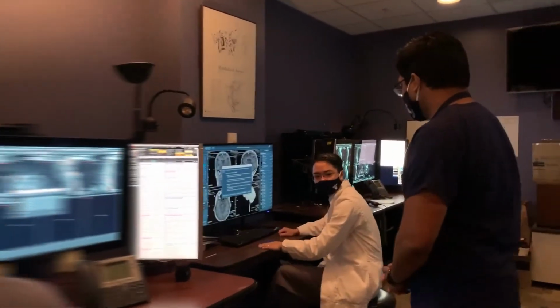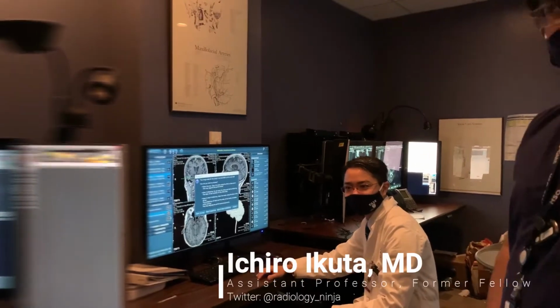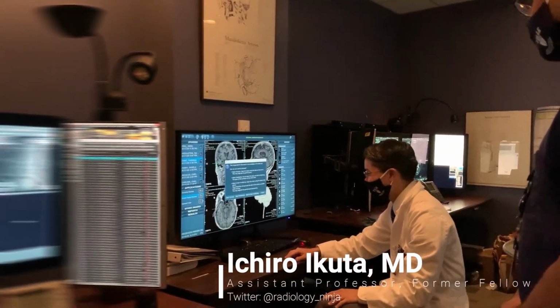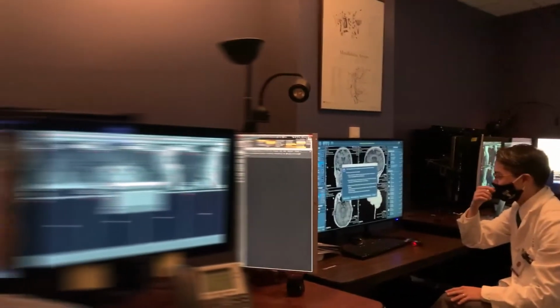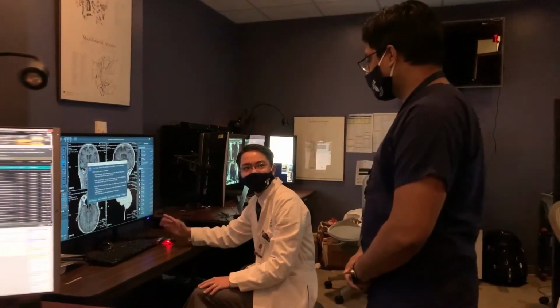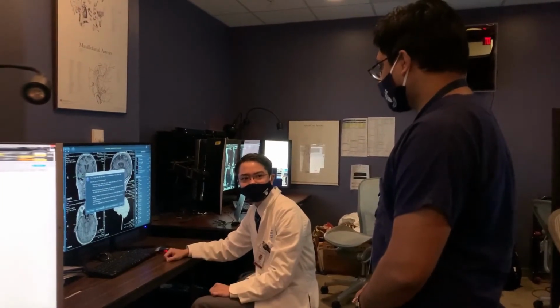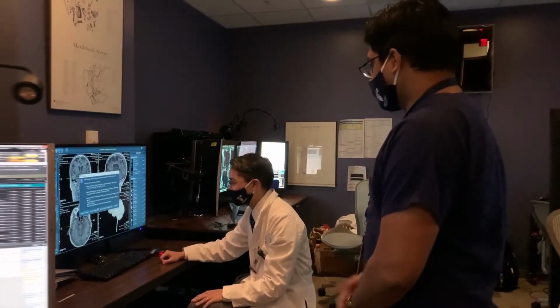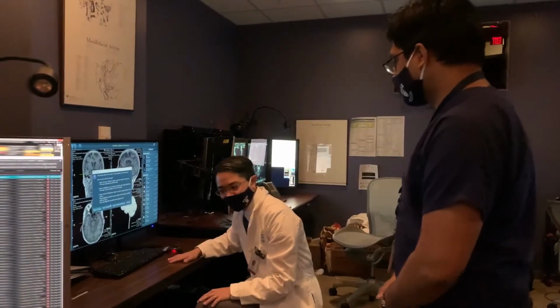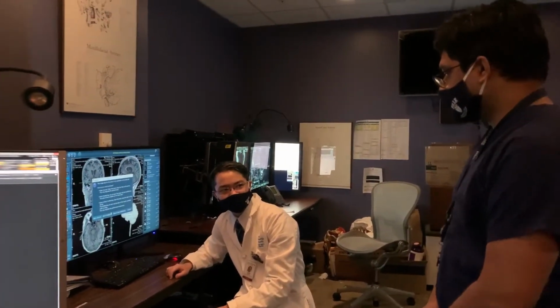Dr. Kuda, how are you doing? One of our faculty members. Hey, everyone. Radiology ninja. So what are you doing here? I'm doing a brain perfusion. Patient had surgery, and so sometimes we do that to see if there's any changes that give us a clue if there's tumor coming back or not. And how long have you been at Yale? I did fellowship here, and then I've been on faculty for about 3 years.